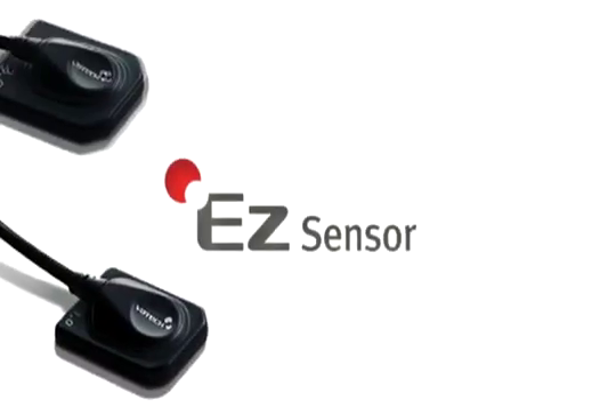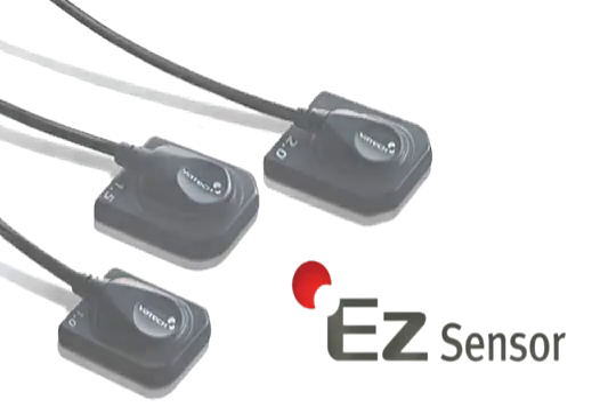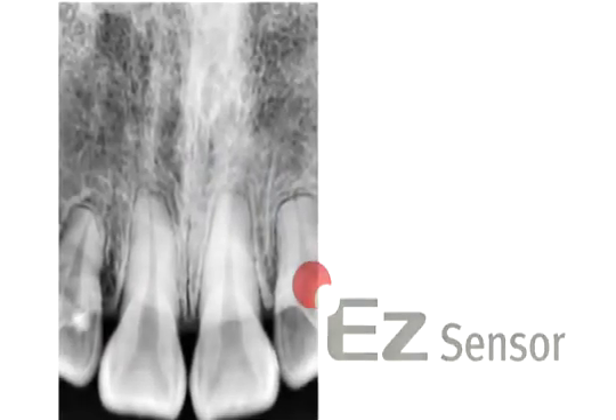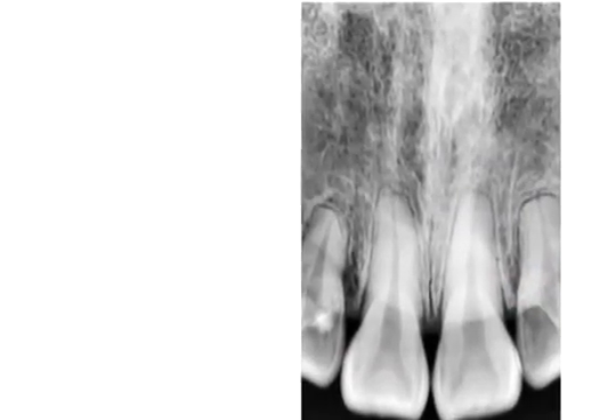Introducing the EZ-Sensor intraoral sensor from Vatech America. The EZ-Sensor allows you to easily capture high-quality radiographic images while yielding the most advanced intraoral diagnostic capabilities.